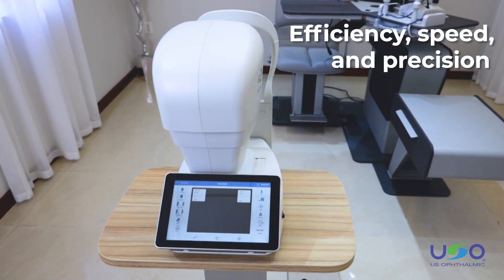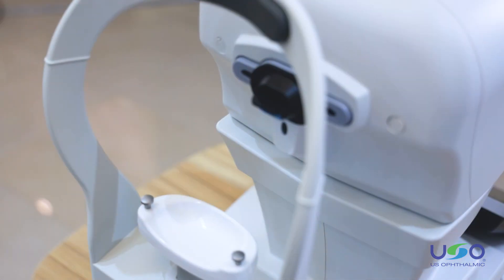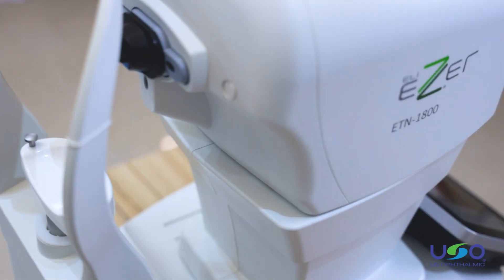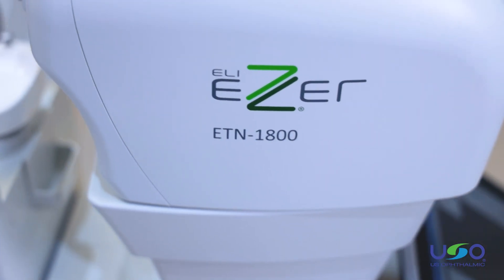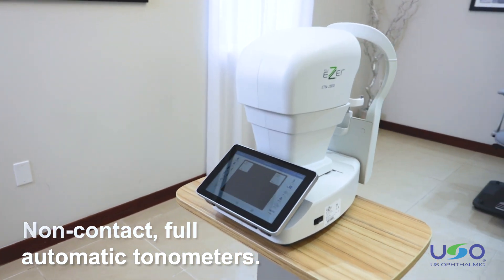Efficiency, speed and precision are fundamental in the practice of modern medicine. To effectively achieve these factors, it is essential to have the right tool. That's why Ezer has launched the new non-contact, fully automatic tonometers.